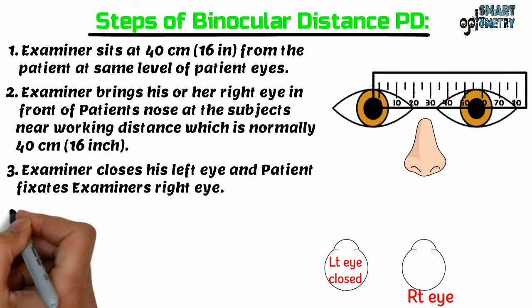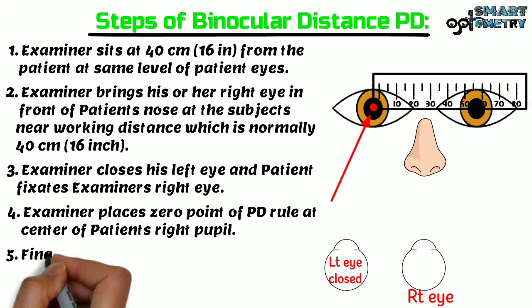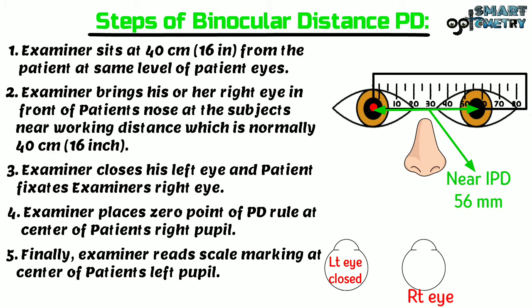The examiner places the zero point of the PD ruler at the center of the patient's right pupil. Then the examiner reads the scale marking at the center of the patient's left pupil. Here you can see the patient's near interpupillary distance is 56 mm.